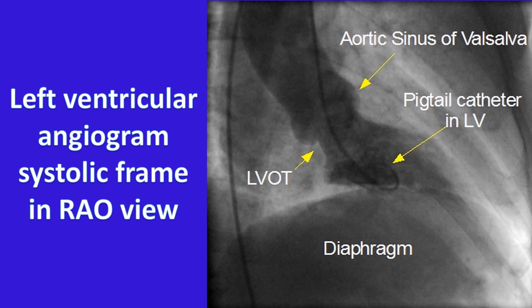Left ventricular angiogram in the RAO view is usually taken to check the regional wall motion, left ventricular function, and mitral regurgitation if any.